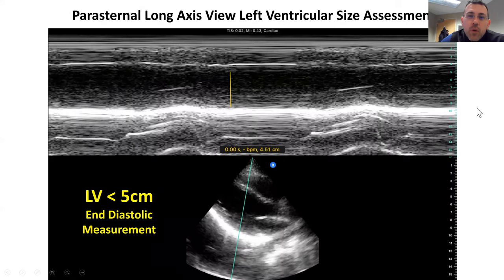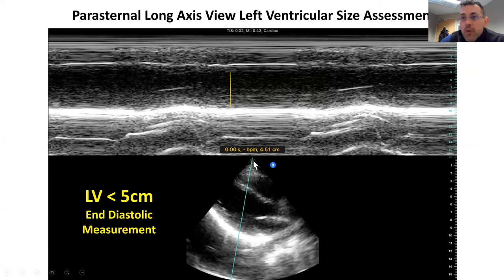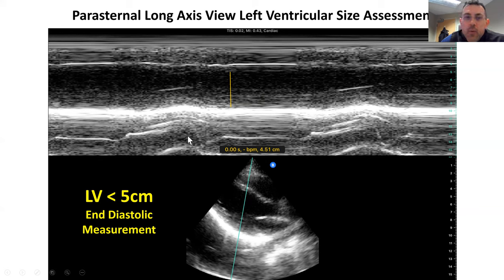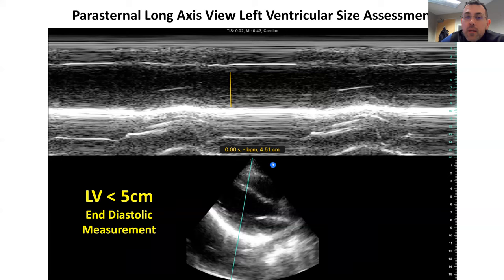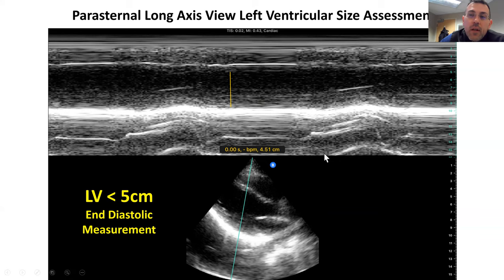In addition to the left atrium, we're also interested in the ventricle, and we can do the same thing. We take our M-mode and have it come down through the left ventricle, somewhere around mid-papillary or proximal to the papillaries. We look for our contraction — systole and diastole — and find an area of maximum diastole. With calipers drawn across, we get a size of 4.51. We want left ventricular size to be less than 5 centimeters, so this is within normal limits.